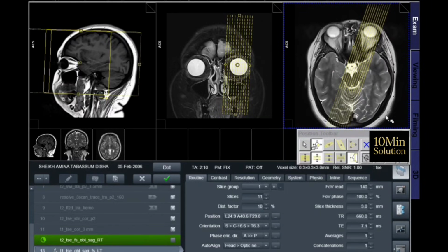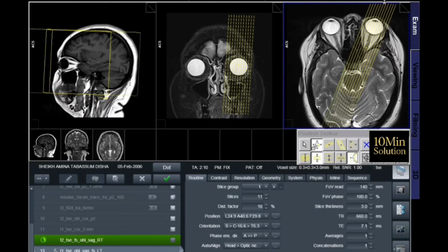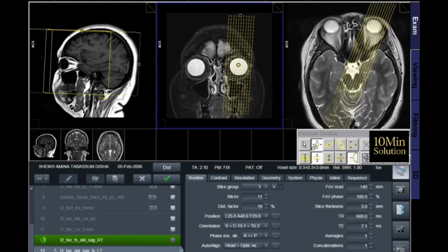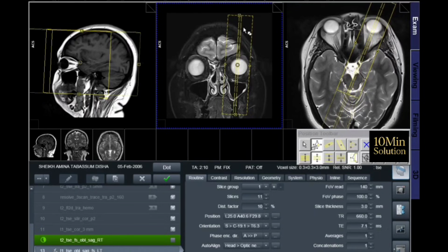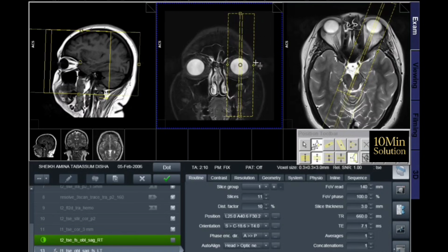In conclusion, proper MRI brain and orbit planning is not just about obtaining good-looking images, it is essential for ensuring accurate diagnosis. Strong planning skills are a defining quality of an excellent MRI technologist.